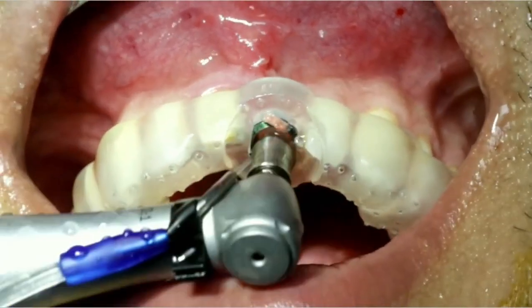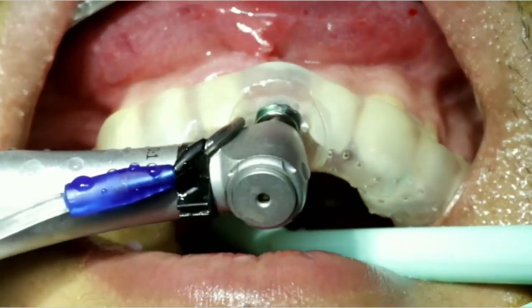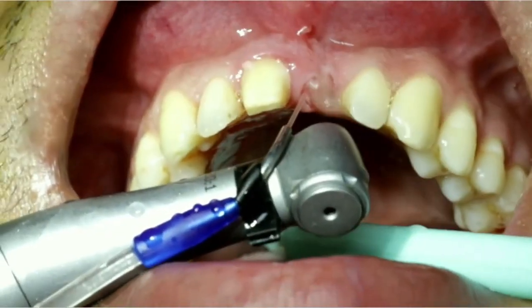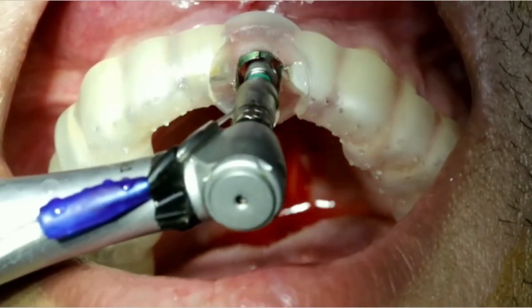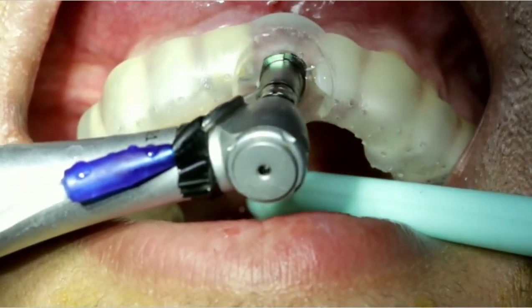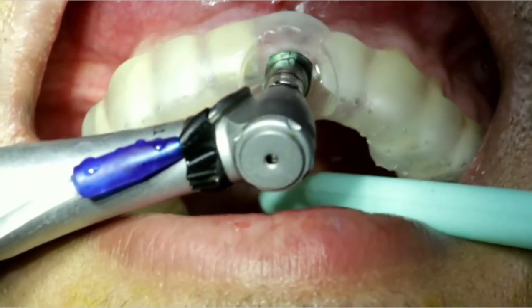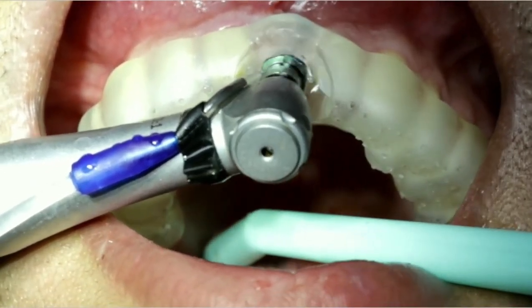Here is creation of the bed, and our osteotomy site is created exactly as we planned. Note the guide and the location of the site. Then here is the implant insertion through the guide. So we ensure the plan which we accomplished first is translated in the exact manner.